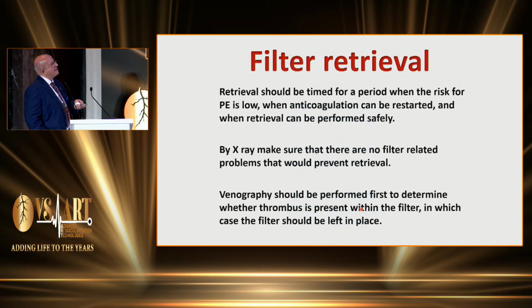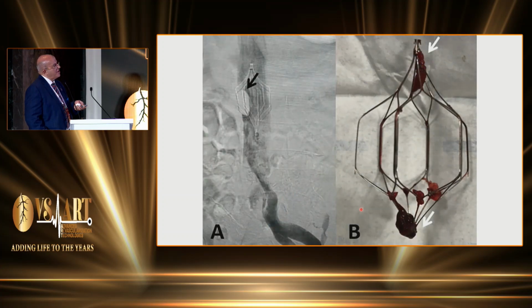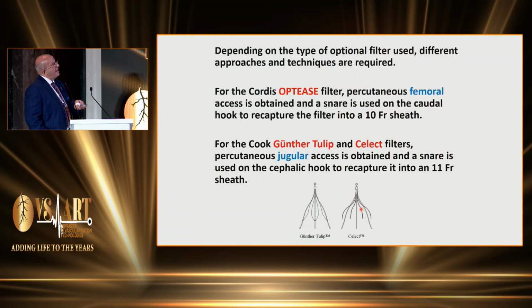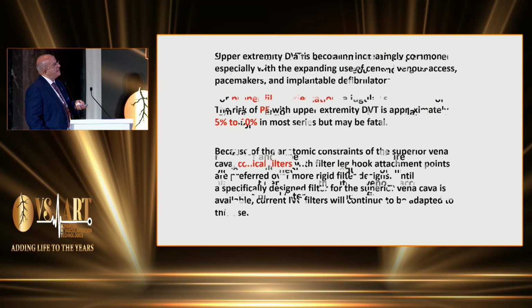There is filter retrieval, and it is a method of retrieval of the filter through the femoral or jugular access. And these are the types of filters that we can retrieve.